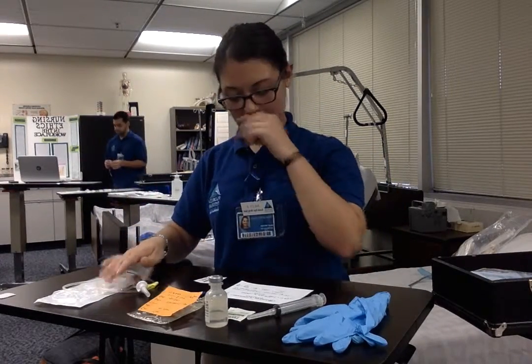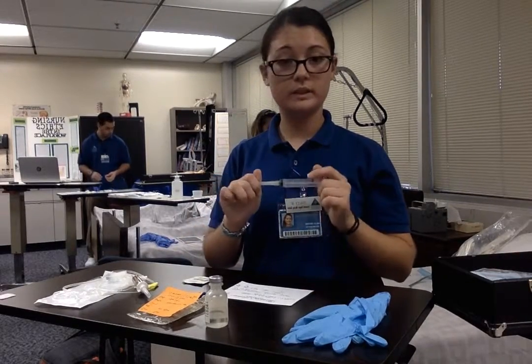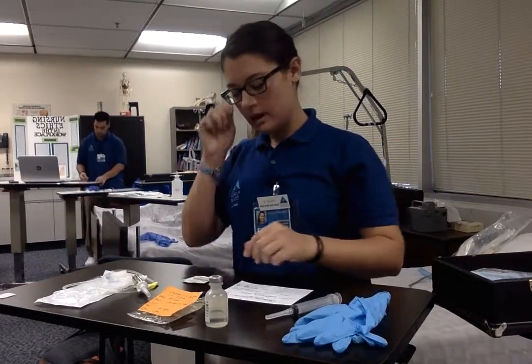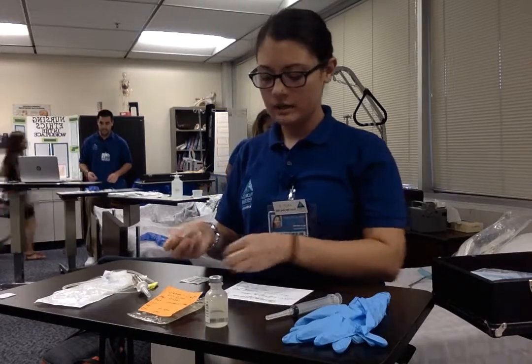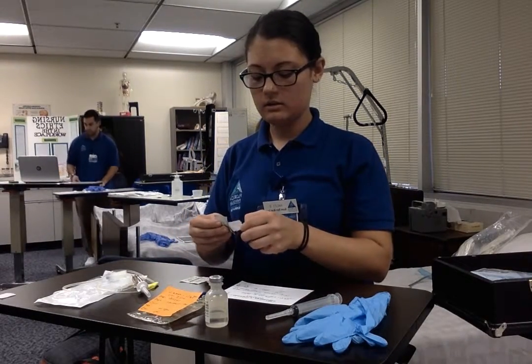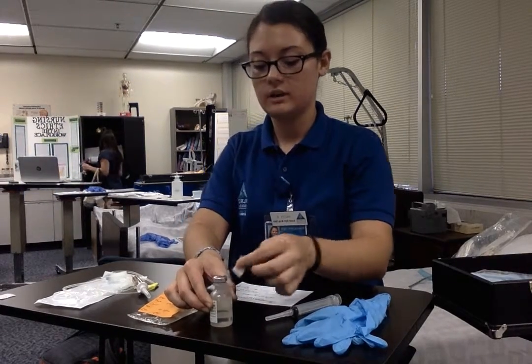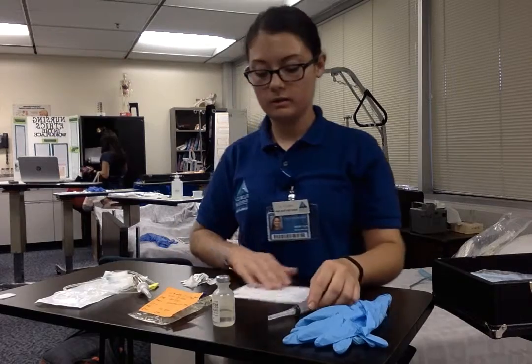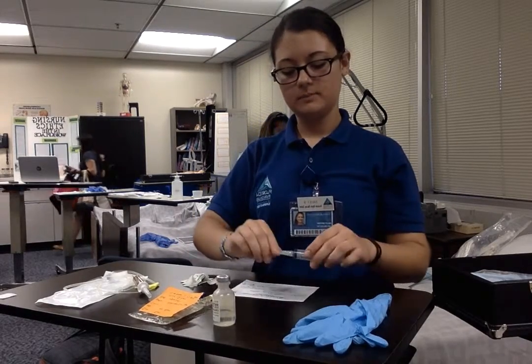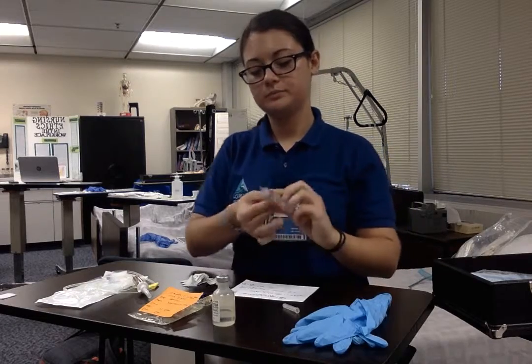I'm going to go ahead and I have some alcohol preps, and I have a syringe with a blunt tip and gloves. Since I'm in the room, I could do gloves, but I'm going to go ahead and take my alcohol swab and clean the top of this vial. Like I said, I already know that I'm going to be grabbing 1 ml according to my calculations. So, like normal, we're going to go ahead and draw up 1 ml.